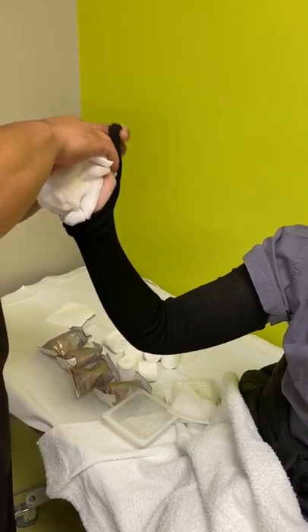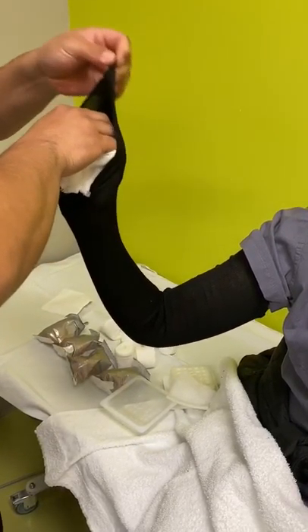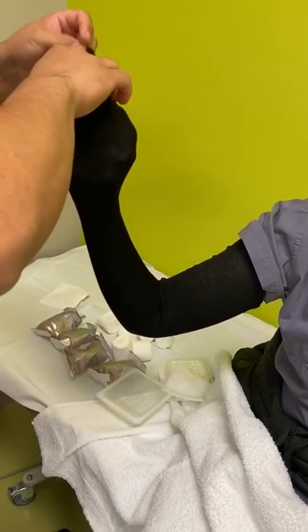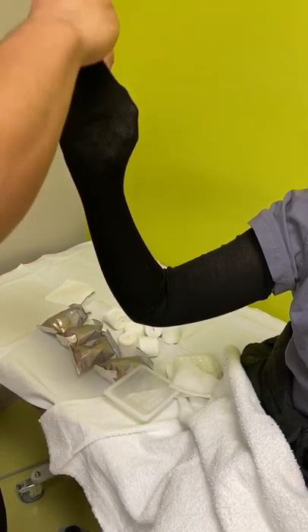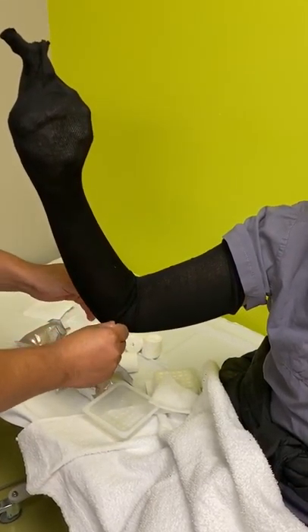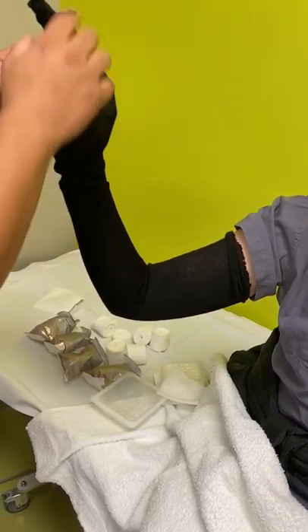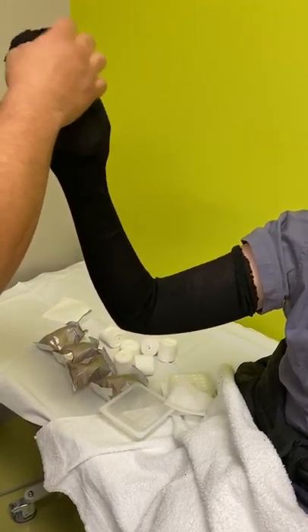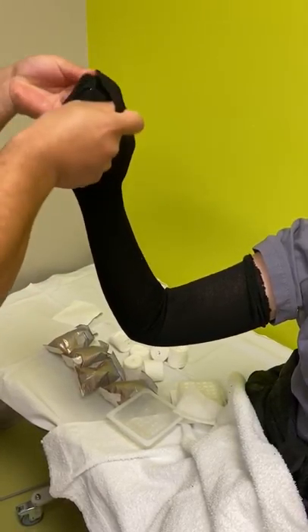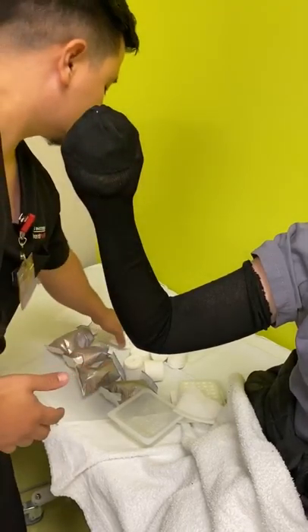Ray has put a lot of four-by-fours and gauze in between the fingers and in the palm of the hand, to essentially keep it in a club form so that you're not getting any rubbing of the fingers or the nails. At the top, he twists the stockinette and then rolls it over so that there's a smooth finish.